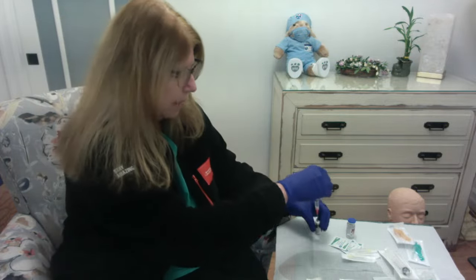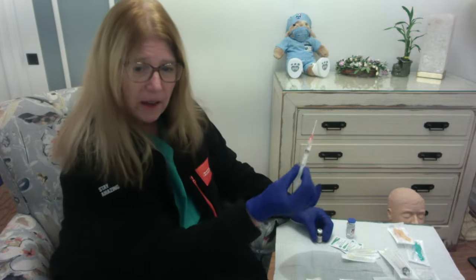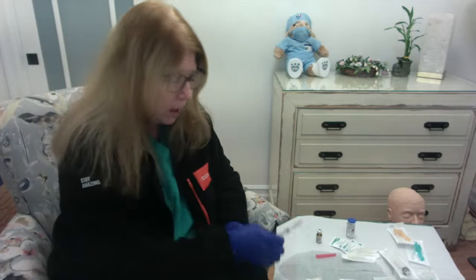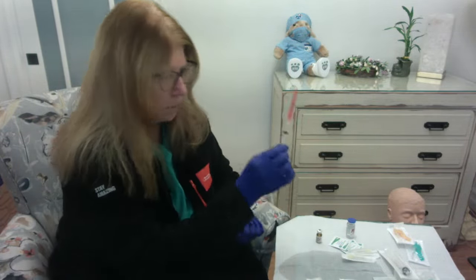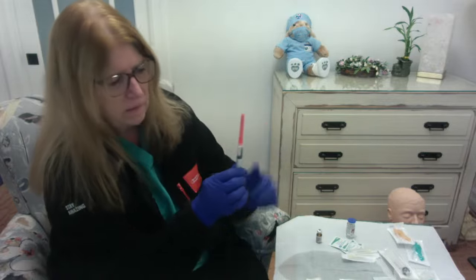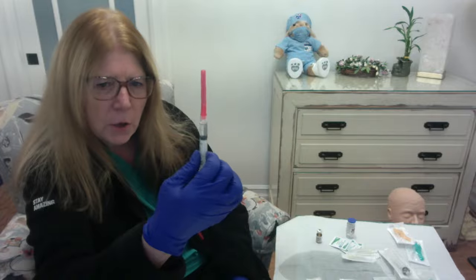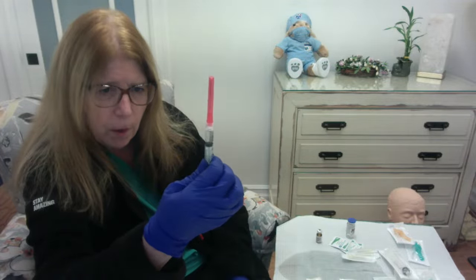I'm going to turn it back, put the vial down, take the needle out, and safely recap this needle, one-handed, and then snap that back in place. So I have my 1 milliliter of medication, okay?